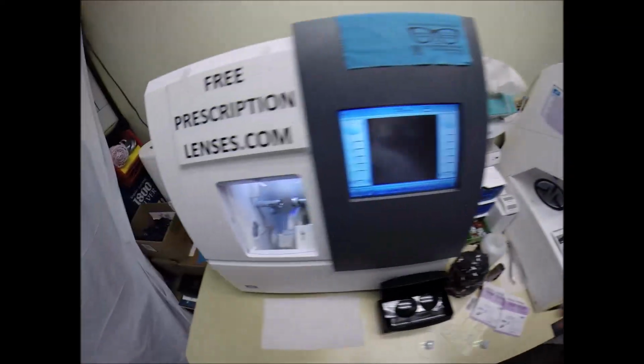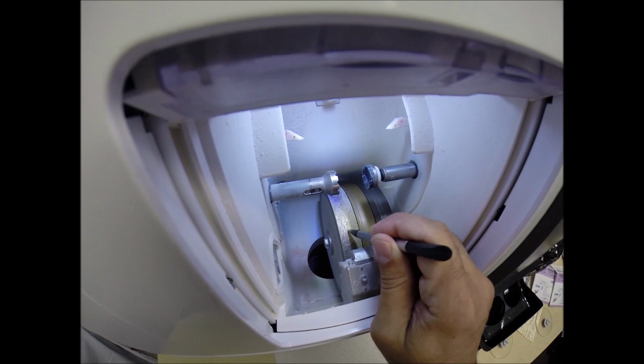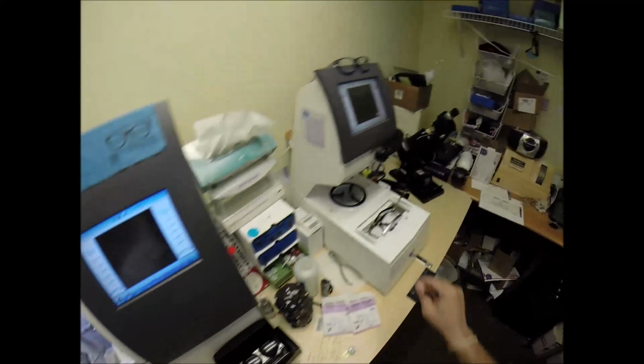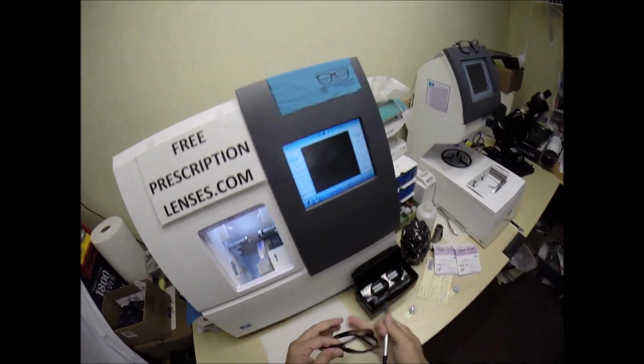But the actual cutting wheel is over on the far left. It's a diamond crusted wheel that's going to grind away your lens material until it's the final size. This wheel in the center is going to put the V-shaped bevel on the lens so it stays inside the bevel of the frame.